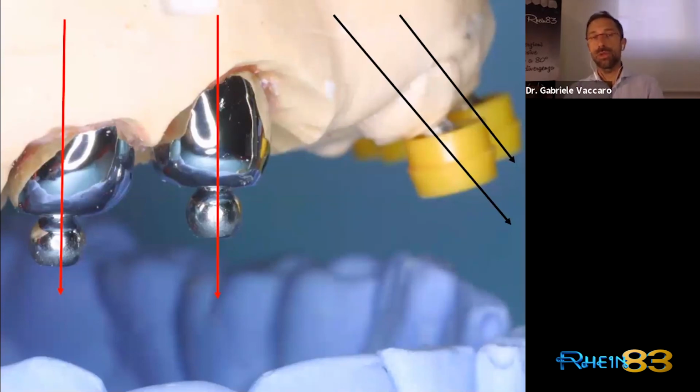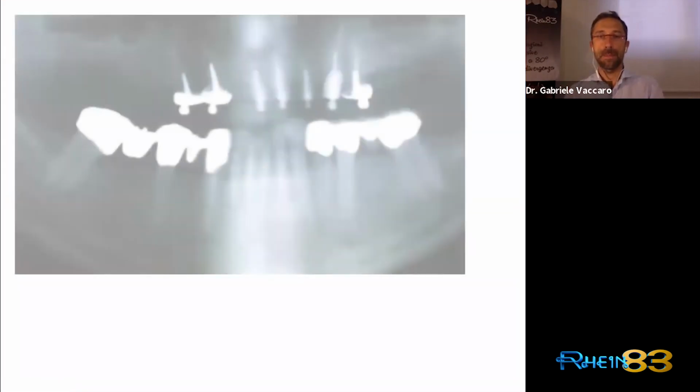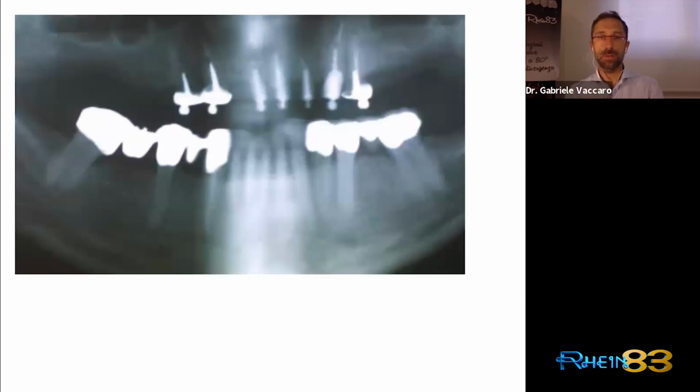This kind of solution prevents fracture in a better way, especially, and new decay from the roots, because it covers everything and gives a mechanical reinforcement of the root, while the direct root doesn't give any reinforcement for the root. And this is the situation.